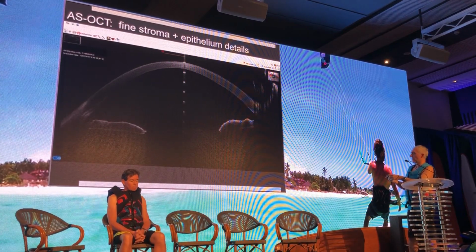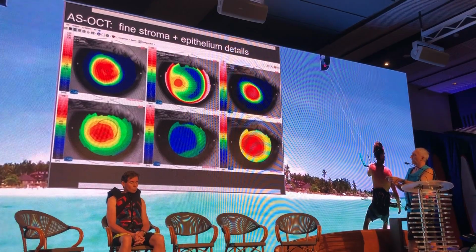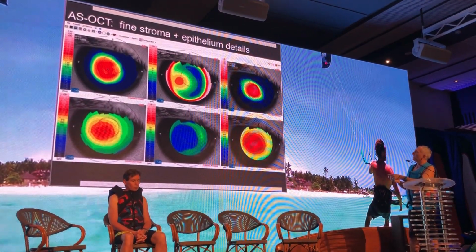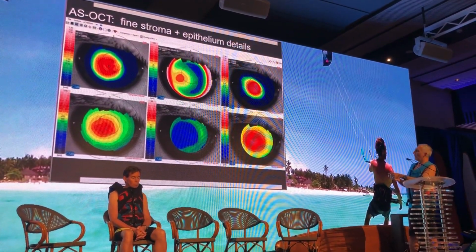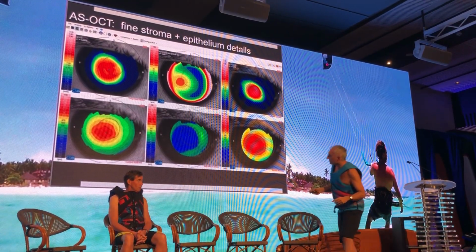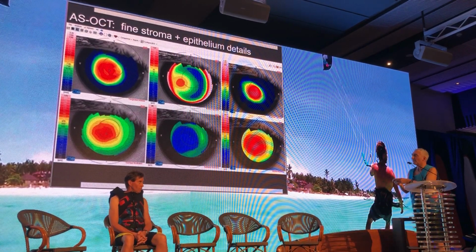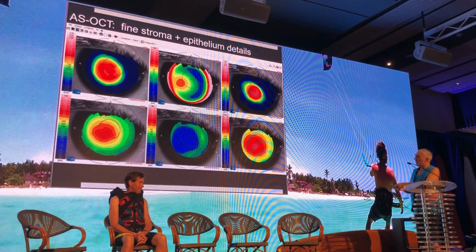there is something that is not perfect, and that is keratoconus, of course, and I can't read. And you see how I can't read from here really. Excuse me. I counted on being able to read it. Yeah, now also the image is not great.